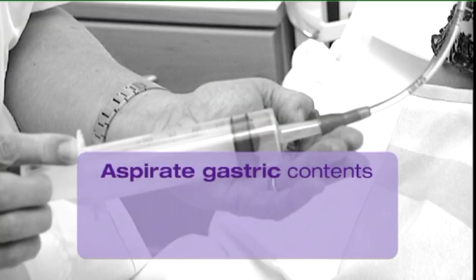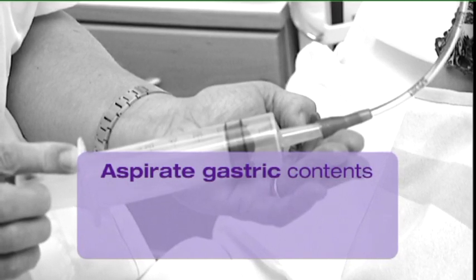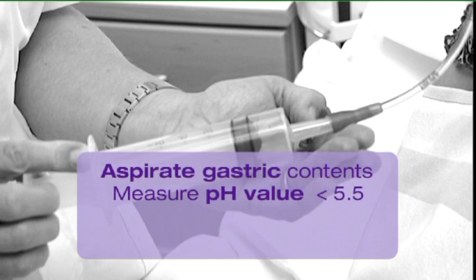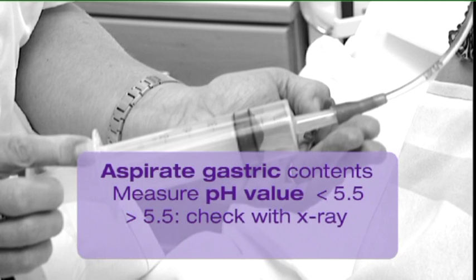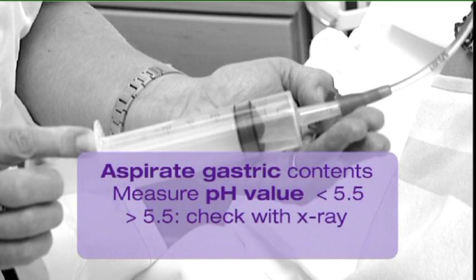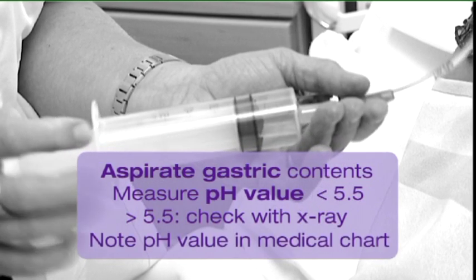Subsequently, check if the Flocare tube is adequately placed in the stomach through aspiration of gastric contents. Measure the pH value of the gastric contents using pH paper. The tube is correctly placed in the stomach if the pH value is below 5.5. If the measured pH value is higher than 5.5, the appropriate tube placement needs to be confirmed through X-ray. The tube is visible thanks to the radio-opaque line. Note the pH value in the patient's medical chart.